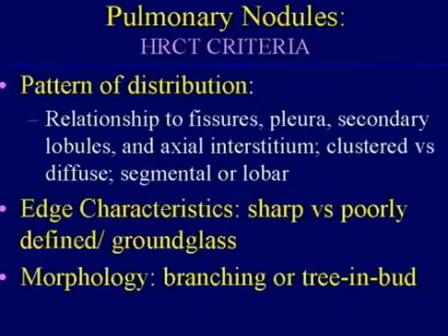And there's really a logic to how to approach this problem of diffuse nodular lung disease. And it's a problem that we encounter all the time. And if you follow the algorithm I'm going to develop, the chances of you getting to the right diagnosis really are substantially enhanced. It is a very practical thing that I want to share with you right now.